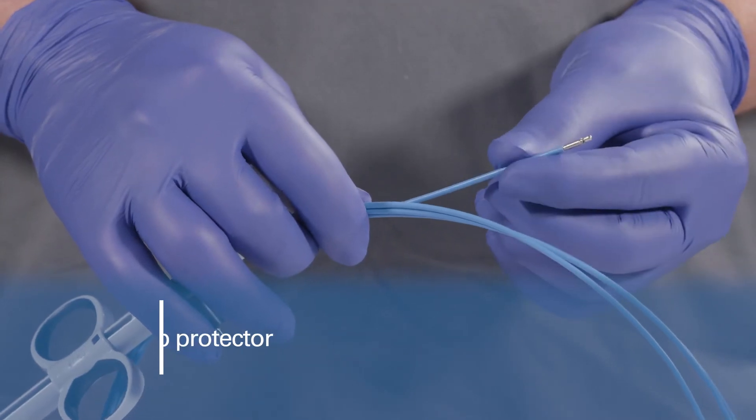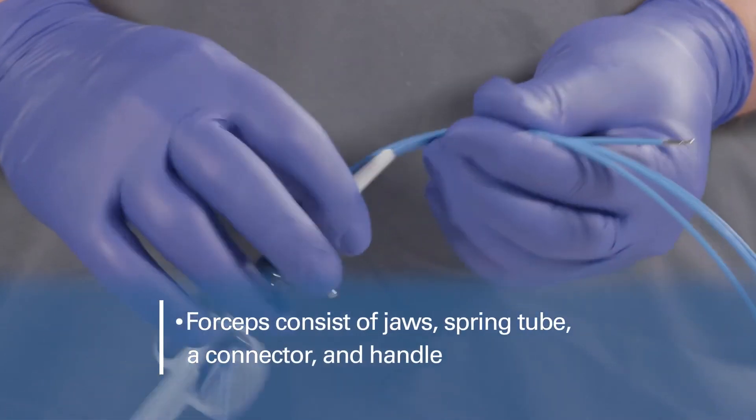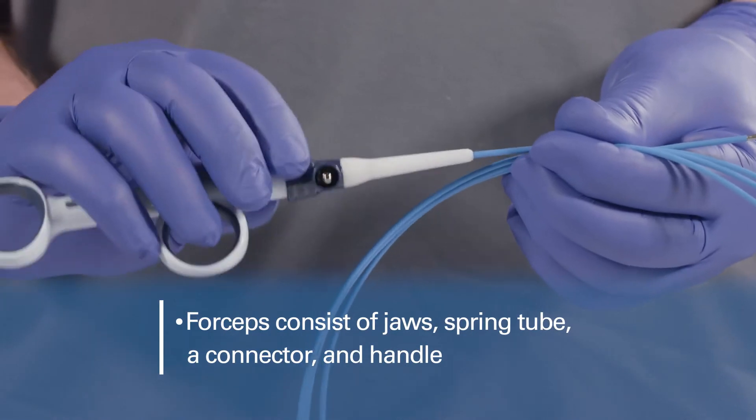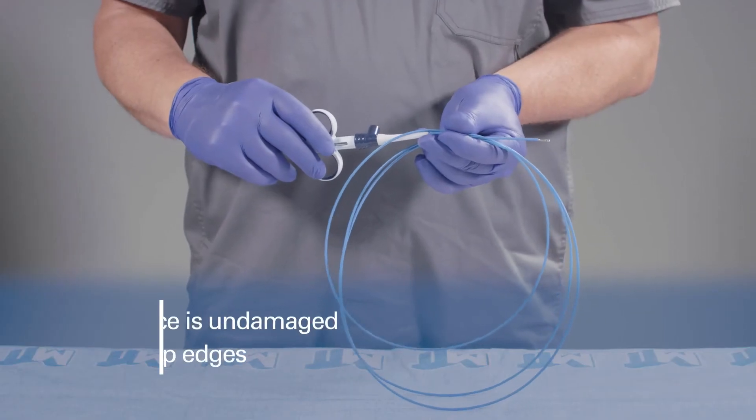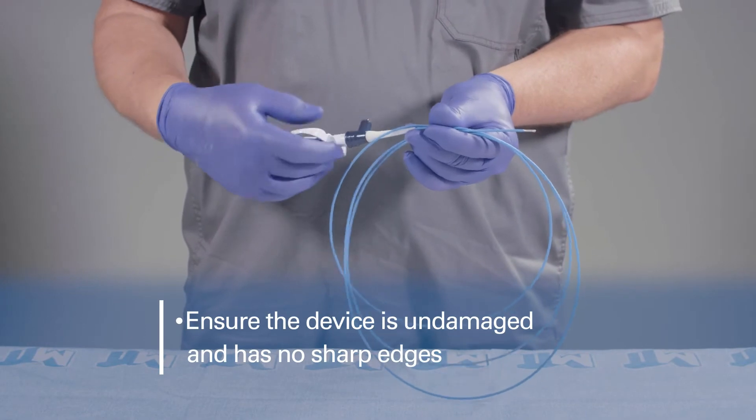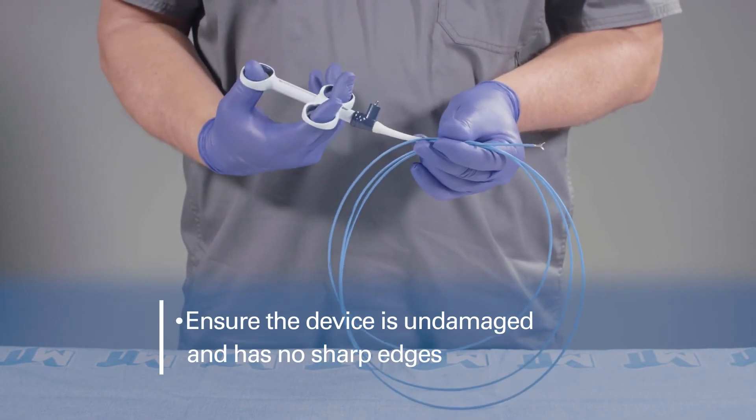The forceps consist of jaws, a spring tube, a connector, and a handle. Prior to use, ensure that the device is undamaged and the jaws and spring tube have no sharp edges.